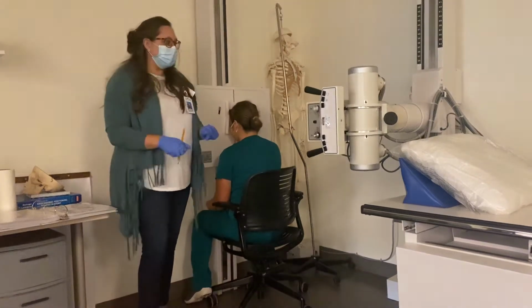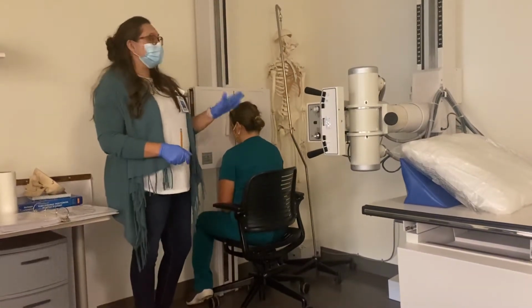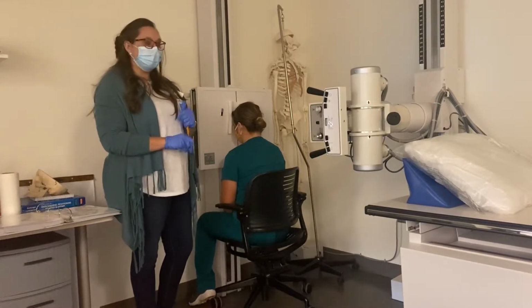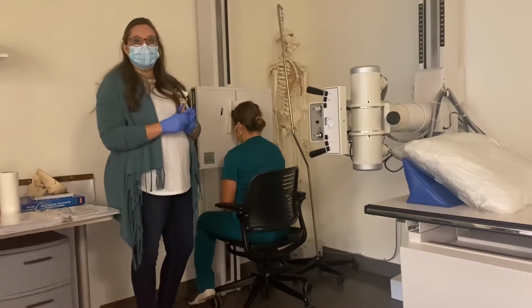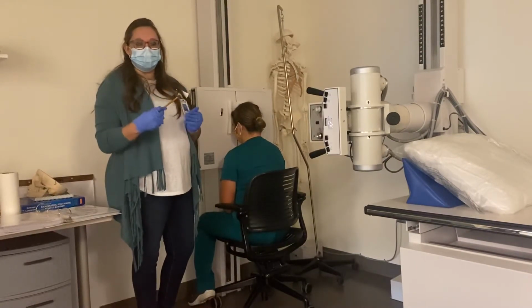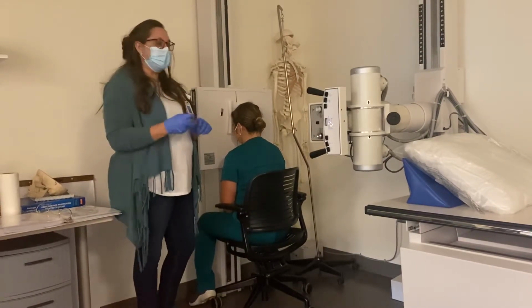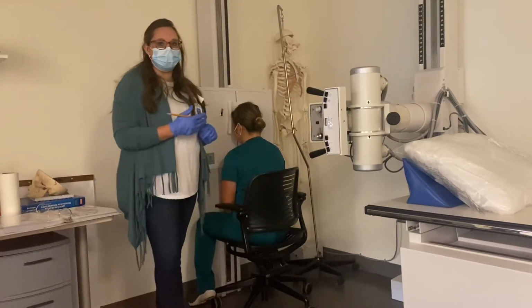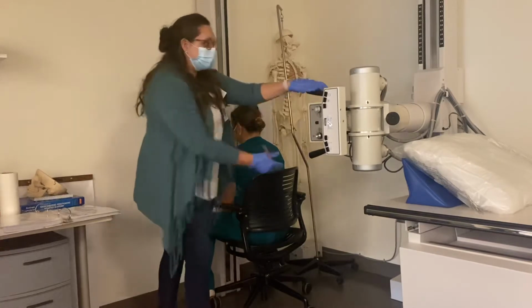All right, so I'm gonna go over sinuses. Again, sinuses are gonna be at 40 inches. You can ask the exact same history as you would use for facial bones, with the only difference asking if they have any sinus pain or pressure and which side that would be on and if it's causing headaches. A lot of times the most common reason for sinus x-rays is sinusitis, which is chronic sinusitis.